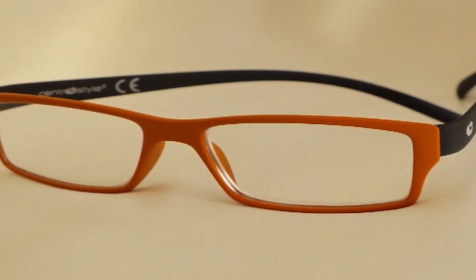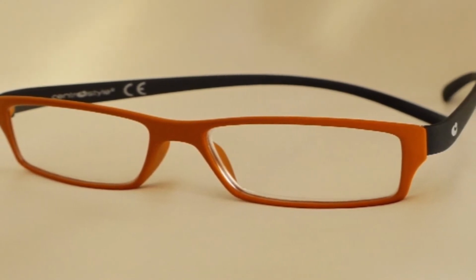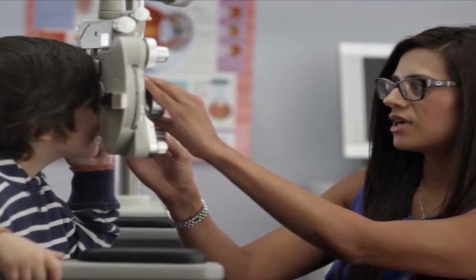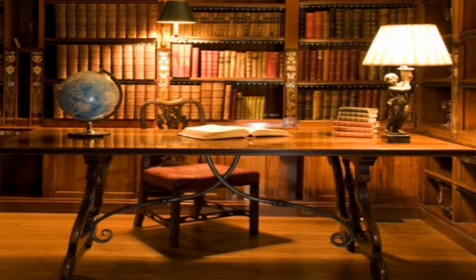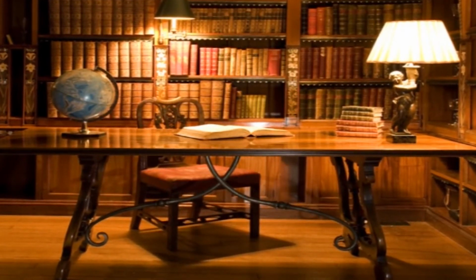When you begin to use reading spectacles, the eye needs more time to accept the power of the lens. So, we ensure that the patients gradually increase the reading time in order to reduce the strain. Another important factor to be kept in mind when using a spectacle magnifier is the lighting.